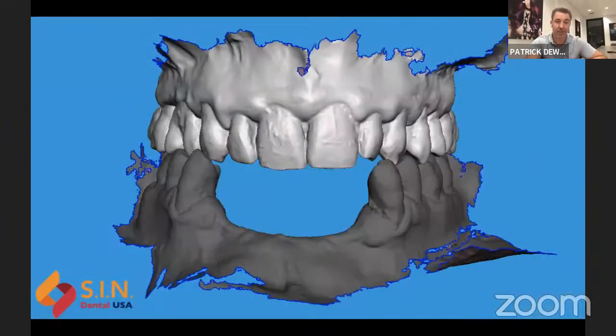After you capture your 3D facial scans or 2D photos, the next piece of diagnostic data you'll need is intraoral scans with an intraoral scanner. A lot of people ask us what type of intraoral scanners are applicable for this. On the pre-op stage, when natural teeth are present, it's very common that most scanners will do the job just fine.